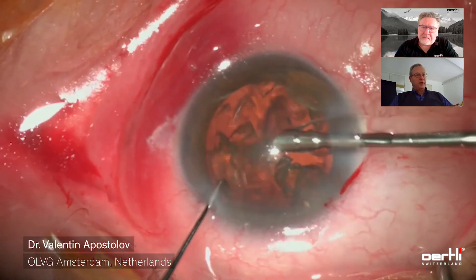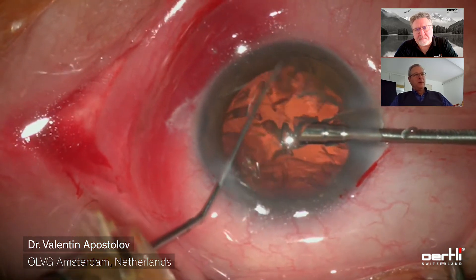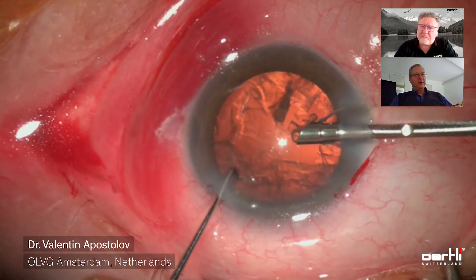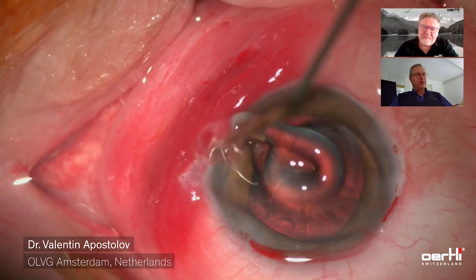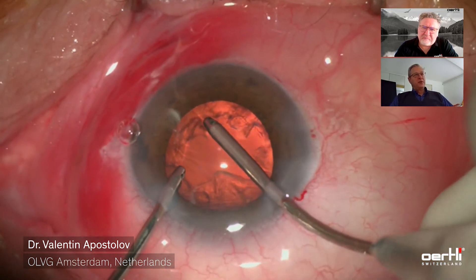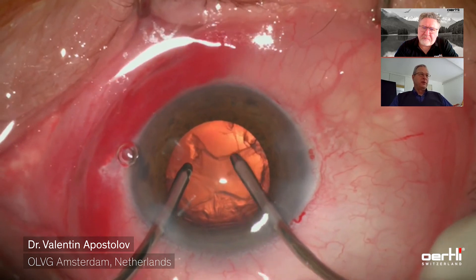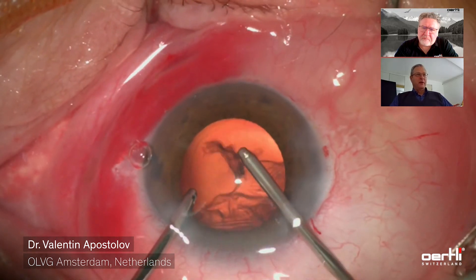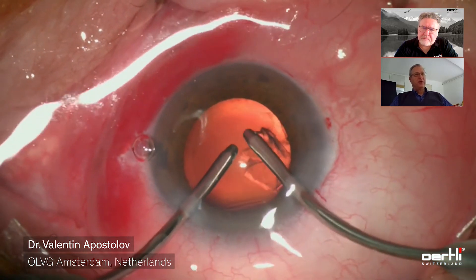Removing the last pieces of nucleus — one has to be very careful with the last bits, because there is nothing between the FACO tip and the posterior capsule. Now the nucleus has been removed. Next is the irrigation aspiration. I like to do that bimanually; it gives me a stable, deep anterior chamber. I can also use the irrigation tip not only to irrigate, but also to hold the capsular bag open by pointing the openings in the desired direction — downwards or in the direction of the piece being removed at the moment.